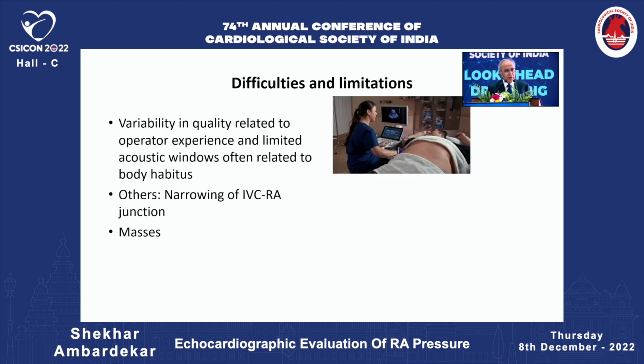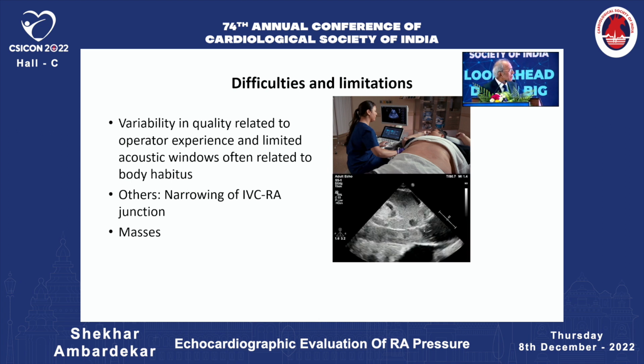Similarly, there will be difficulties. It of course depends on the operator experience, etc., to get a good IVC. Similarly, sometimes in obese patients, it is difficult to get a good IVC image. And sometimes if there is some stenosis at the junction of RA and IVC, then the RA pressure dynamics will not be reflected into the IVC. Or if there is any mass in the IVC, then of course we can't use this method at all. So even if you are seeing the IVC, we can't use it.